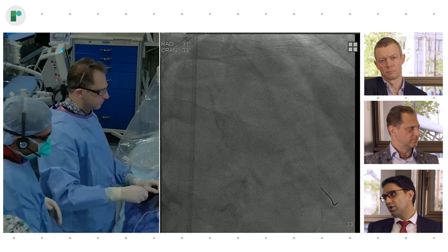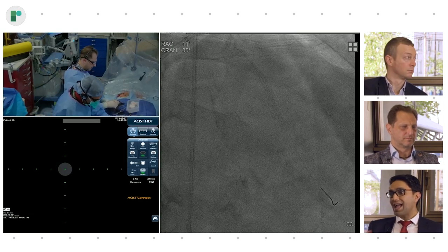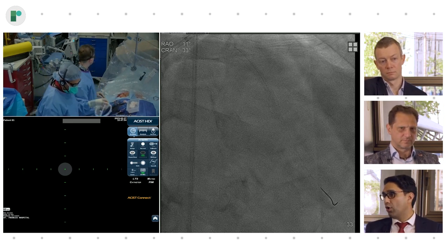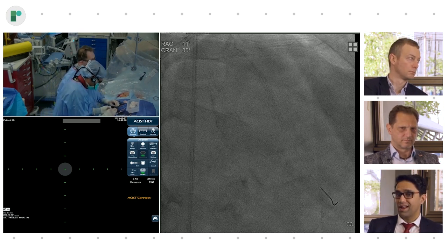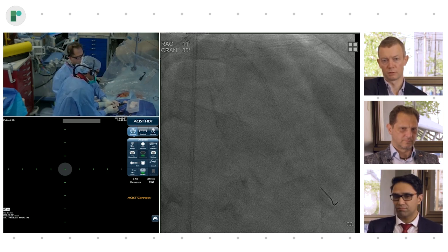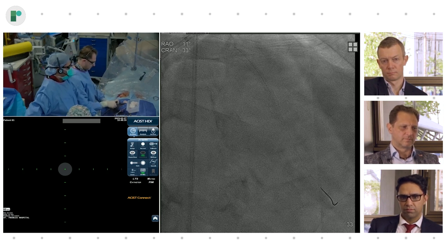So you see how the physiology and imaging combined helped us make clinical decisions. You know, the worst thing we could have done is just jammed a stent in. There wasn't EKG change to say, okay, we're going to go now. Because there was a problem in the distal edge that we clearly needed to rectify. And I think if we didn't, this patient probably would have been at risk for stent thrombosis. Absolutely. Gives you, maybe, if anything, better pictures, right? Oh, definitely. Because we had a specific question to address. And that was, what was the mechanism here?